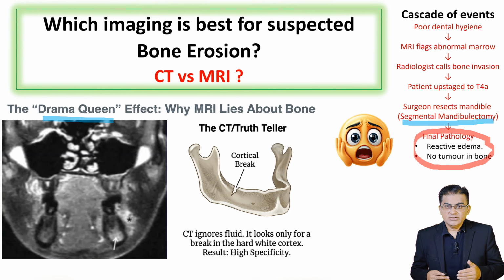So here is your golden rule for clinic. When you are looking at a scan trying to decide if you need to sacrifice a patient's jaw, do not let the MRI panic you. Trust the CT scan.